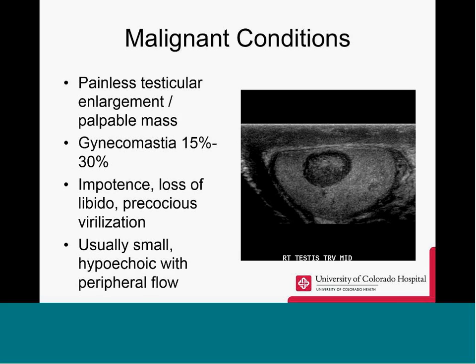They're going to present with a painless testicular enlargement or palpable mass, seeing gynecomastia in 15 to 30% of patients, with impotence, loss of libido, or a precocious virilization. They're usually small and hypoechoic with peripheral flow.